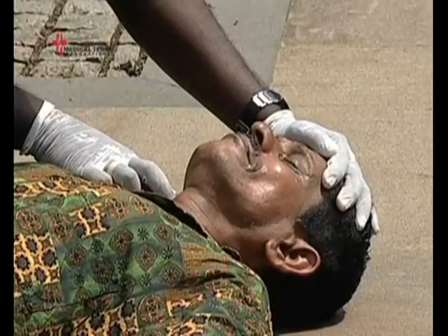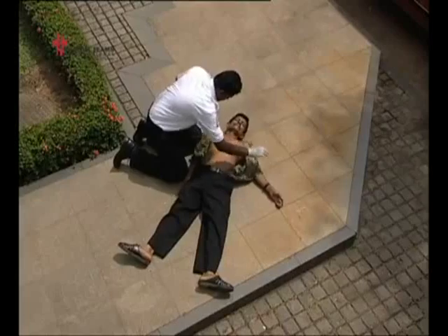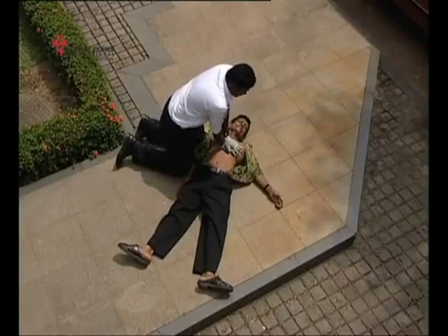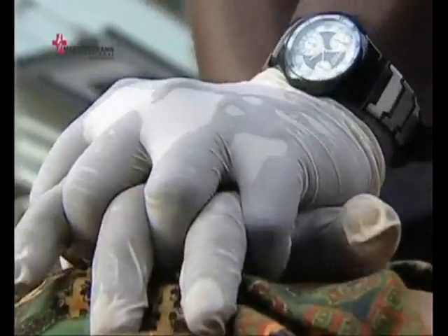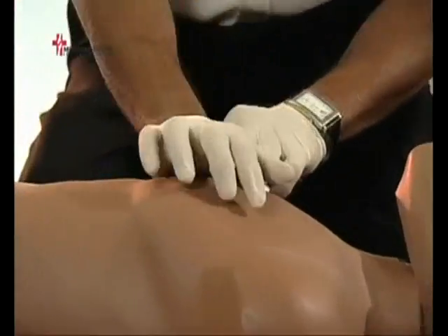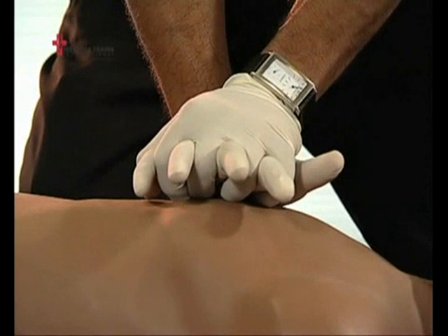Next, check for a carotid pulse for 5 to 10 seconds. If no pulse is found, immediately begin chest compressions. Be sure that the patient is on a firm surface. If not, move the patient to the floor prior to starting chest compressions. Place the palm of your hand in the center of the chest, between the nipples. Interlock the fingers of your hands. Lock your elbows and press down on the chest.